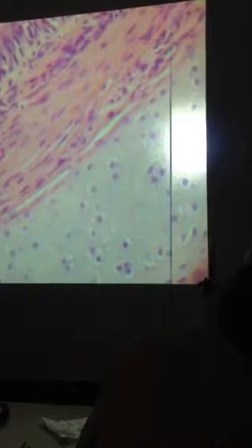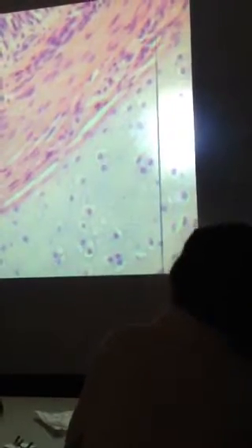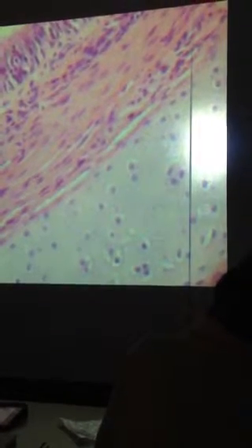All I can see, I like this. Doesn't that look like a little face? Did you ever see the Vincent van Gogh painting where the guy has his hands by his face and goes, ah, doesn't that look like him? See, when you take histology, you see things that other people don't see if you know art. This is why you should take art courses. This is why it's a liberal arts education.